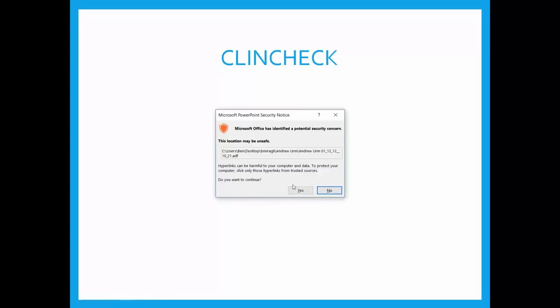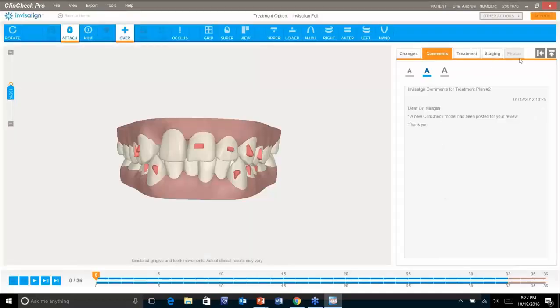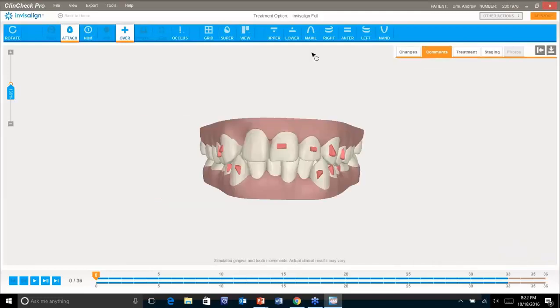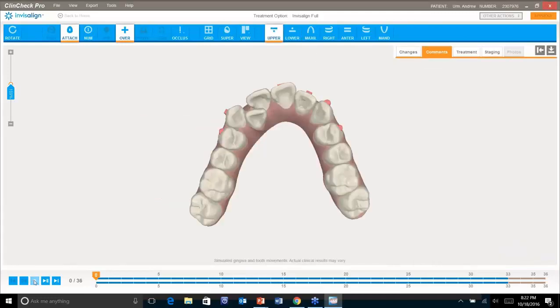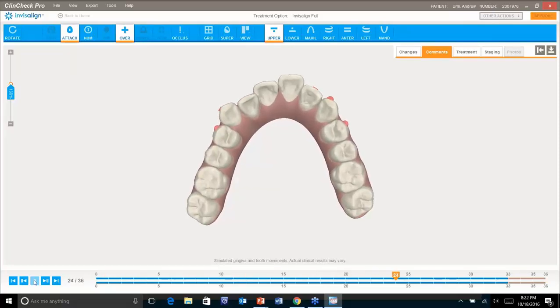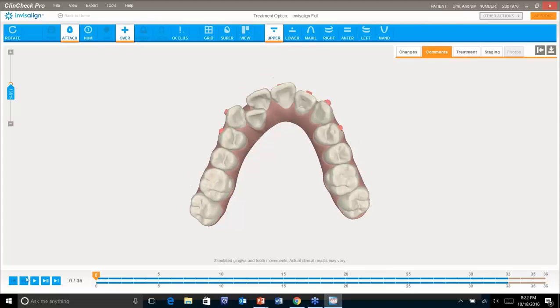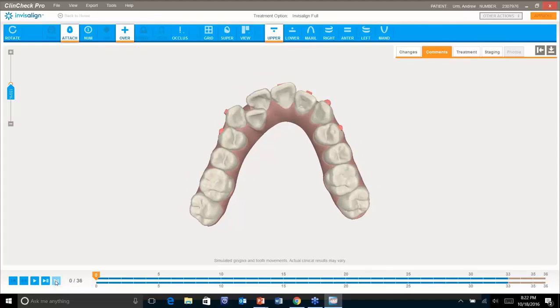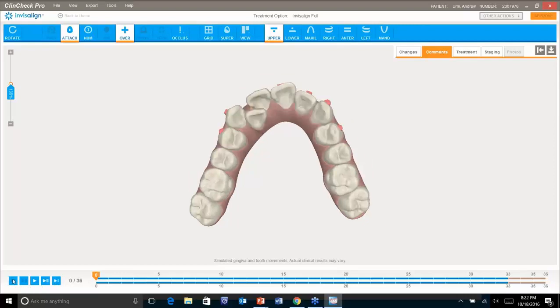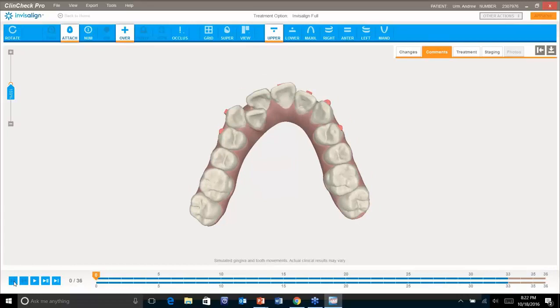Just to give an idea of what the case looks like on the ClinCheck: the upper arch with play shows the aligner count. It took 33 aligners. If wearing them at two-week intervals, that would take about 17 months. A case like this might end up with four to six refinement aligners, rounding off at about an 18 to 20-month traditional time frame.